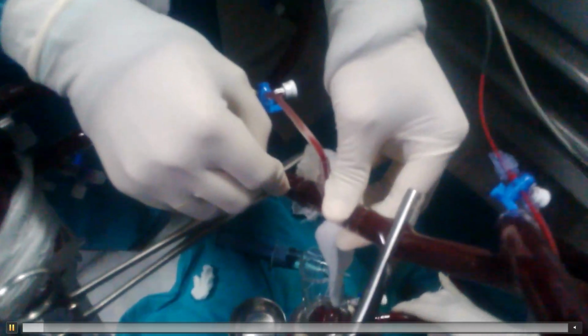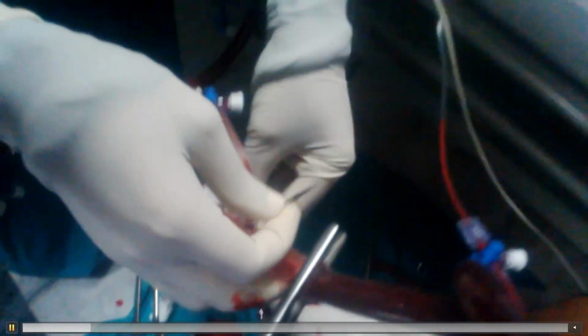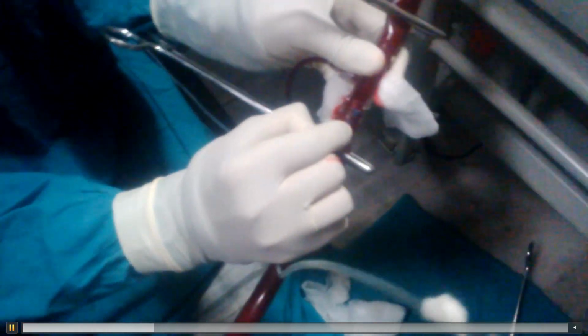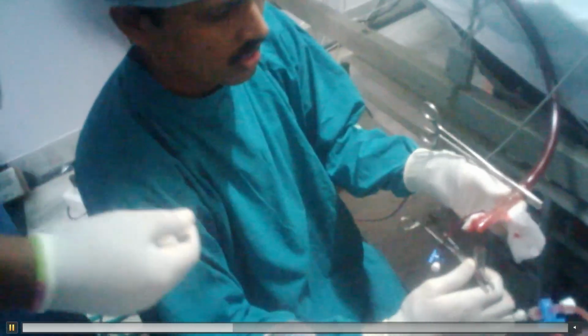So you see the oxygenator is clamped. This is the pre-oxygenator line. There are 2 clamps put on this line, and 2 clamps on the other side. We are cutting both the lines. This is the post-oxygenator, there are 2 clamps. So we are removing this. We have cut this. Now this is the old oxygenator which is going out. Okay, look at the steps.